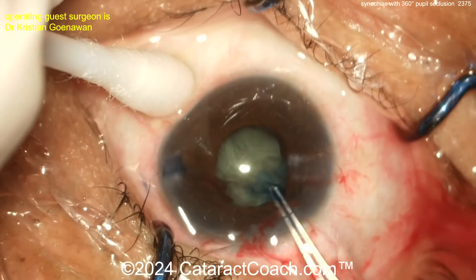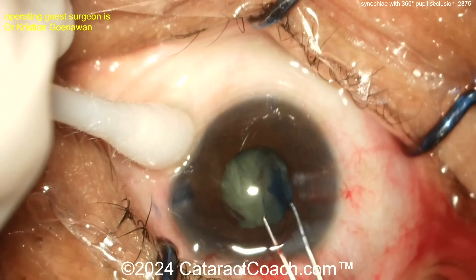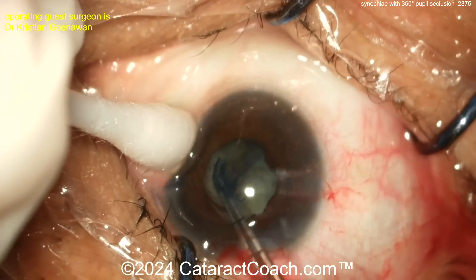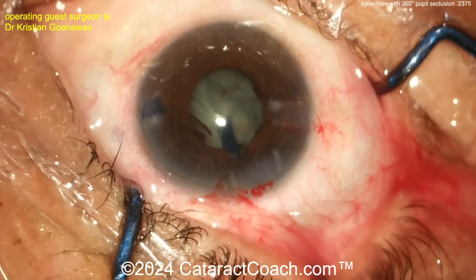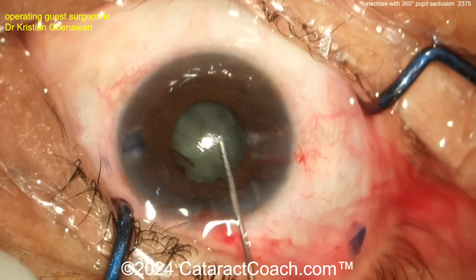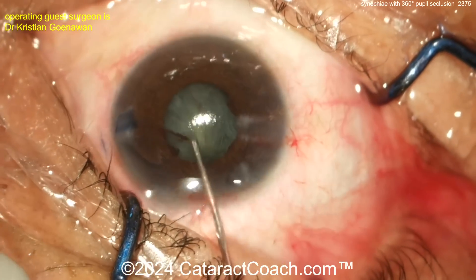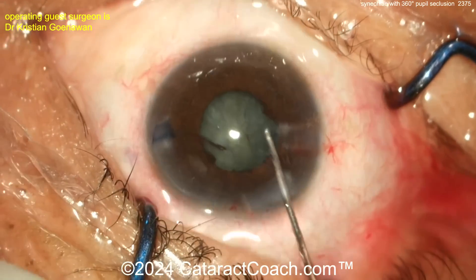The capsule looks a little wrinkly, so doing the rhexis slightly under the pupil margin is fine — and it's being done very nicely here. A beautiful big rhexis is key; the mistake is to make a baby rhexis. The surgeon is doing a fantastic job with a nice generous five to five-and-a-half millimeter rhexis. Now for hydrodissection — in a case like this with a shallow AC, you may not be able to prolapse the nucleus out of the capsular bag.